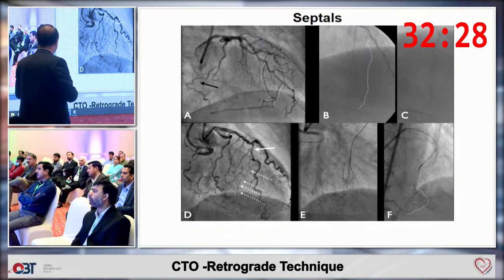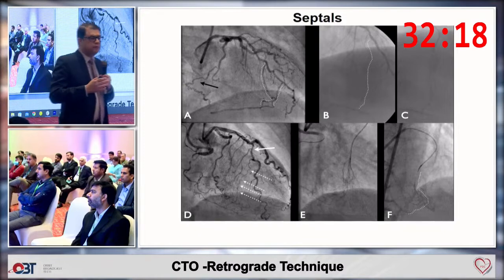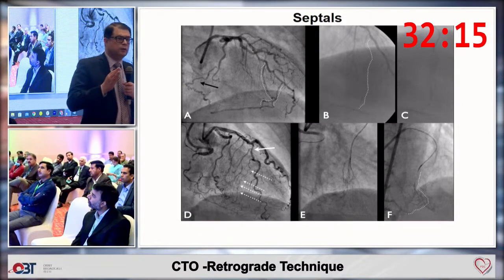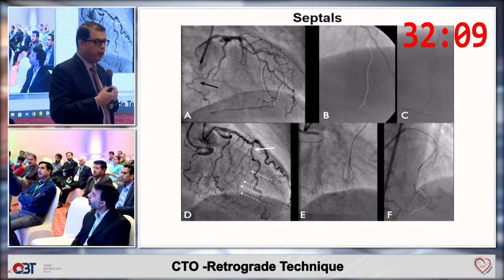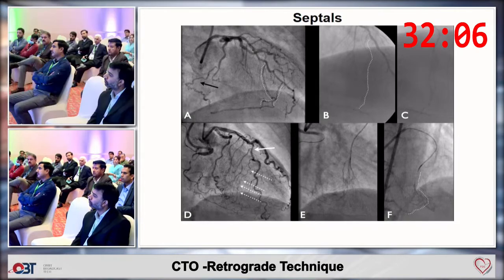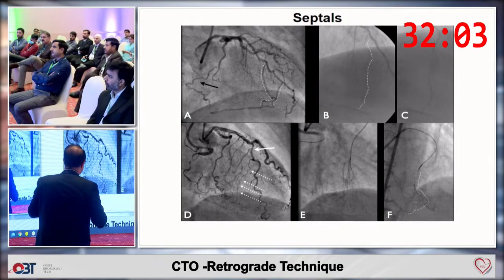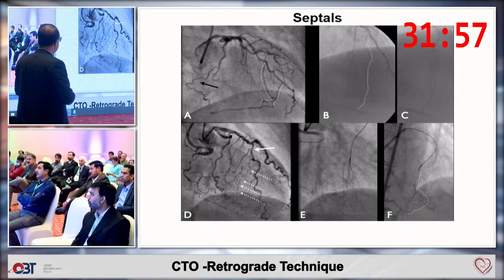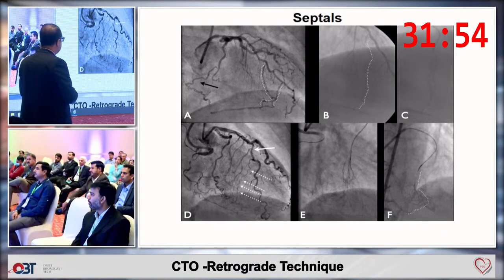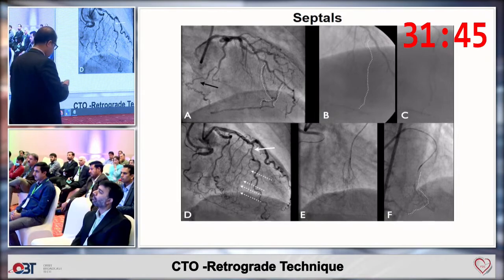Here you can see these septals, small septals connecting to the right coronary artery. Sometimes you don't even see the collaterals, and some people recommend septal surfing, in which you can even cannulate with a Sion Black wire in collaterals which are not visible. But the preferred approach, especially when you are starting a procedure, is to take your microcatheter down, take a picture, and visualize the path of the collaterals in which you have to take the wire. So that is a more assured way of succeeding.